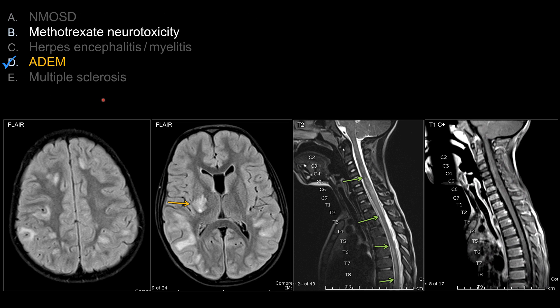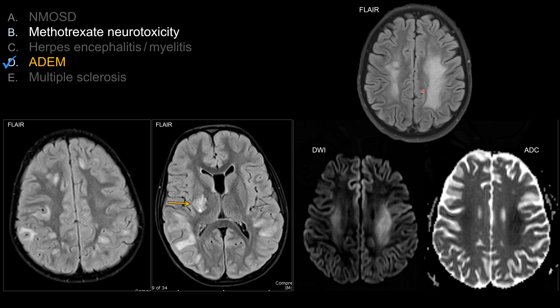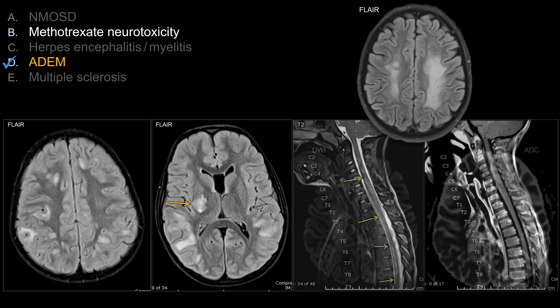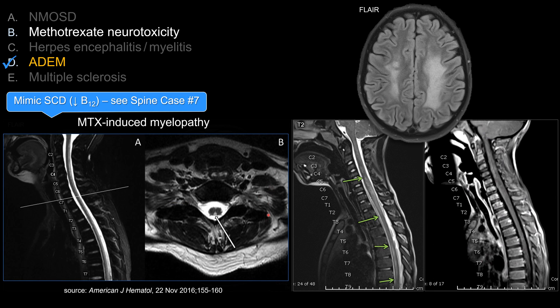For choice B, methotrexate toxicity: the classic picture is confluent abnormal FLAIR signal and diffusion restriction involving the centrum semiovale and corona radiata. Sometimes the diffusion abnormality will occur before you see the FLAIR signal abnormality. If the patient is receiving intrathecal methotrexate, then you have your diagnosis. Importantly, the core involvement of methotrexate toxicity looks essentially identical to subacute combined degeneration due to vitamin B12 deficiency. So if you see dorsal column involvement, the chief differential is vitamin B12 deficiency, with methotrexate toxicity also on the list — check if the patient is on intrathecal methotrexate.